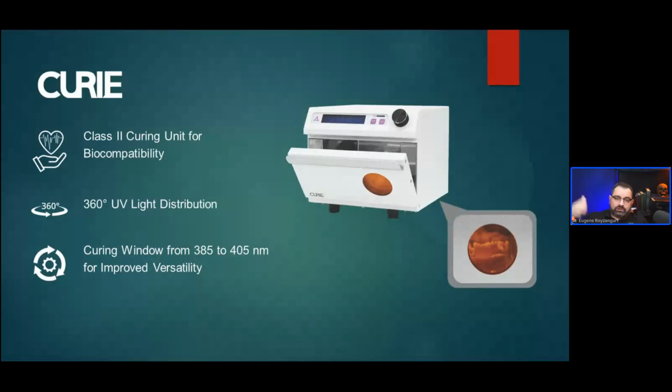The firmware you also need to update through that, but there's no actual physical SD card you need to insert because you have things connected through Wi-Fi and such. But with the Acuretta curing unit, you need to actually download things onto an SD card and put it in there. It's a fairly easy process. Just make sure, one thing I ran into, because mine came with an SD card and a micro SD card, and I tried to upload things to a different micro SD card I had lying around, and it didn't work. I guess the formatting on there was different or something. So watch out for that, because I made that mistake before.